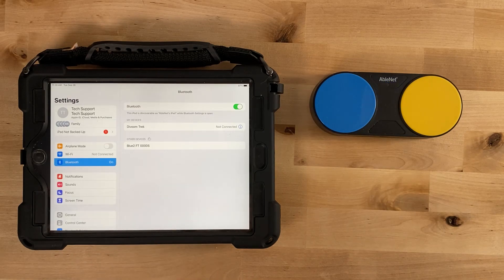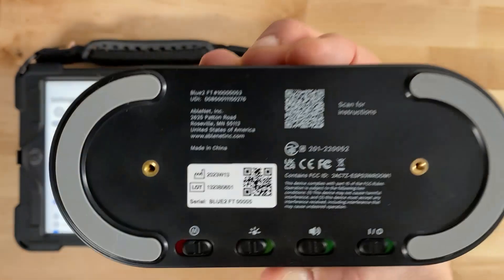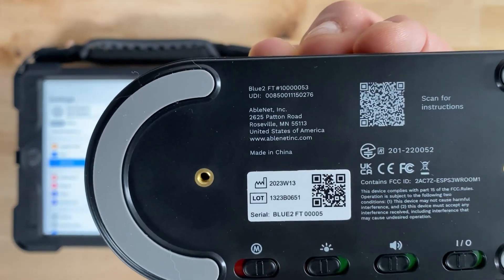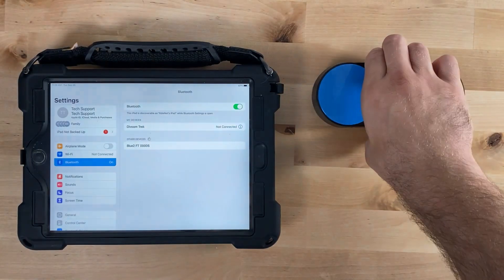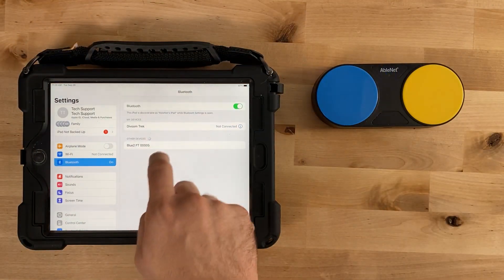These numbers denote the Bluetooth's serial number. If you see more than one Bluetooth listed, look at the back of the Bluetooth and match the serial number on the Bluetooth to the serial numbers shown on the iPad or iPhone.